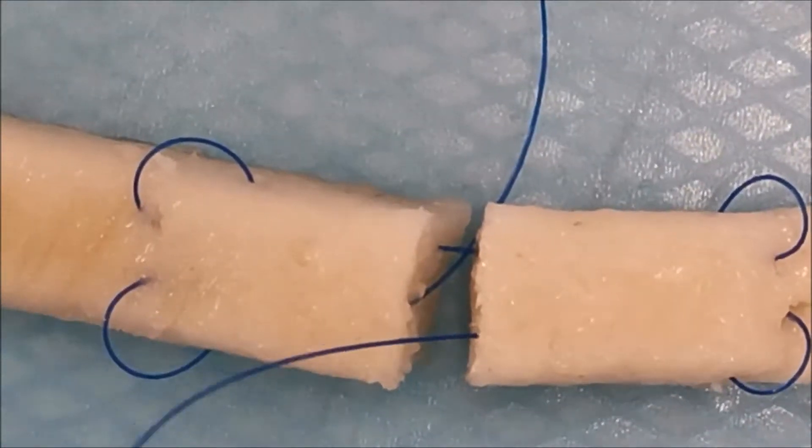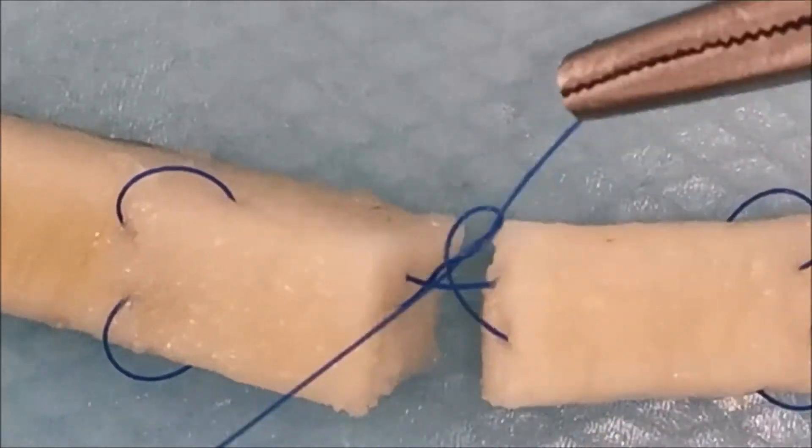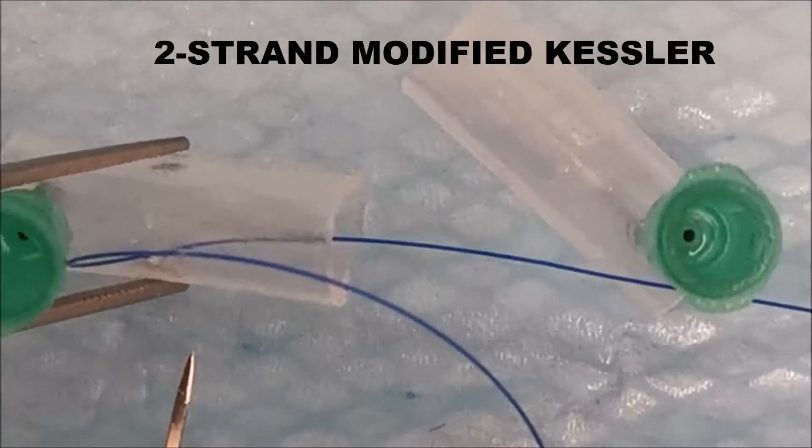Once all four grasping loops are done, you'll see two strands going across the site and the knot is tied.